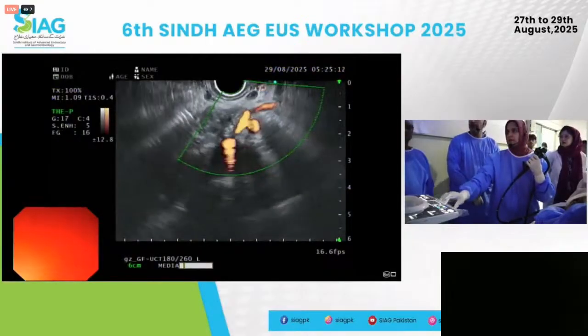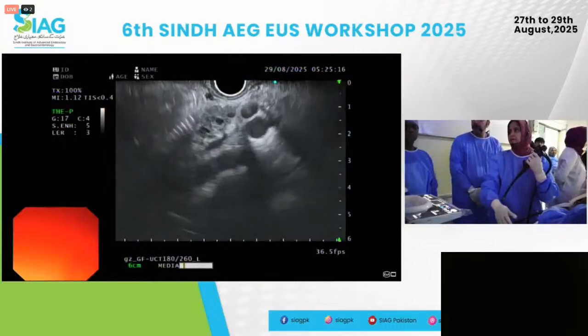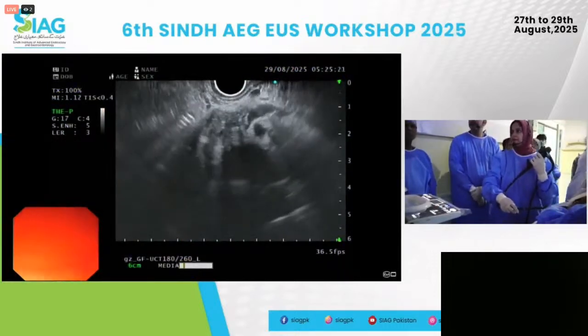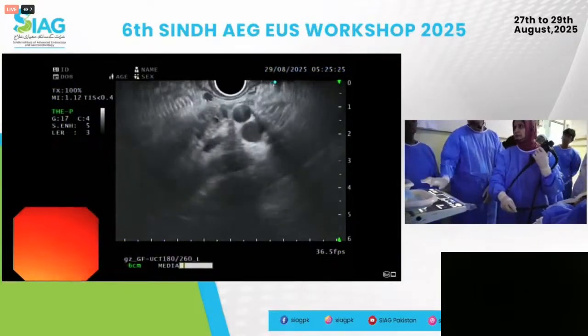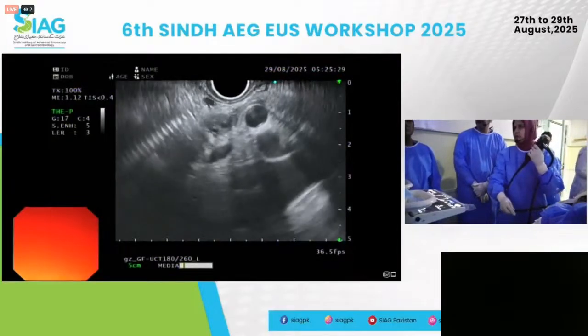Okay. And also just imagine that you are in the stomach. One side is going to be pancreas, other side is going to be liver. So if you're just seeing a liver at the bottom, you have to rotate to the left. That's the pancreas. Because pancreas is at the bottom, right? Dark looking pancreas, and liver is on the left, with slightly prominent BD in the center.